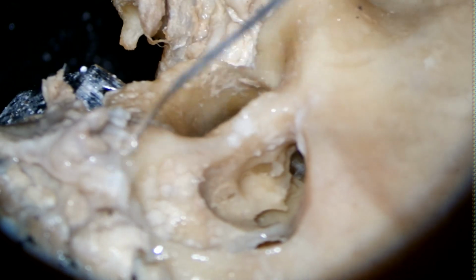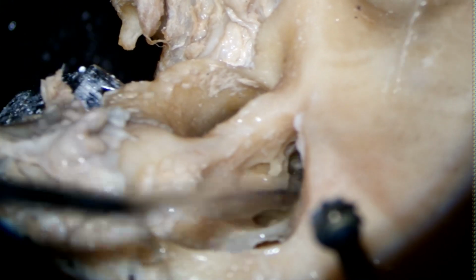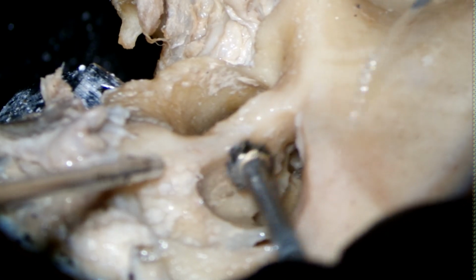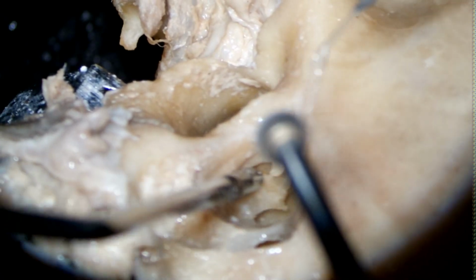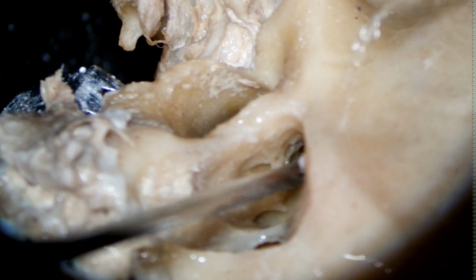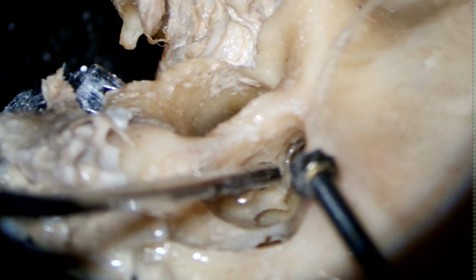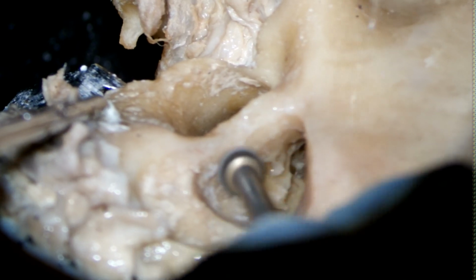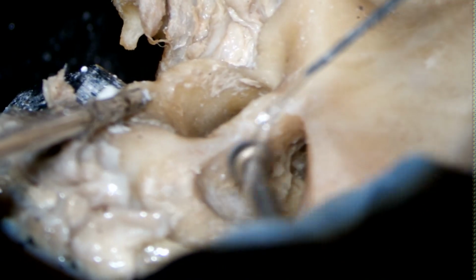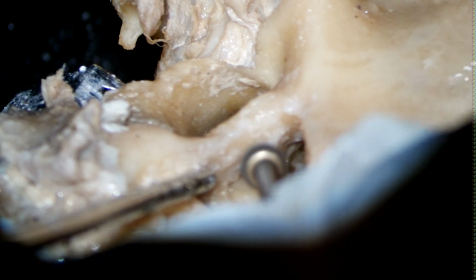Okay, yes. So basically laterally is the chorda tympani, medially is the facial nerve, and superiorly is the incus. And we need to thin the posterior canal wall so that we can do a posterior tympanotomy. Thinning of the posterior canal wall is very, very important.